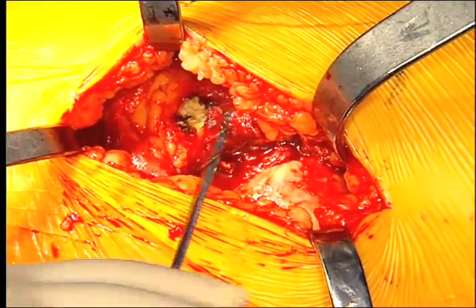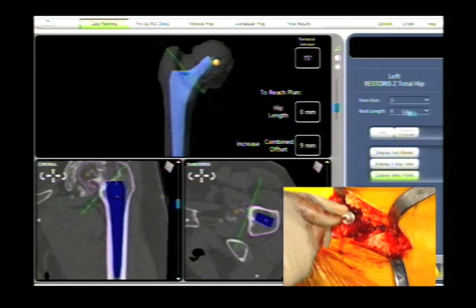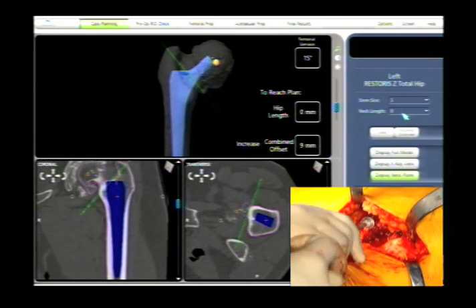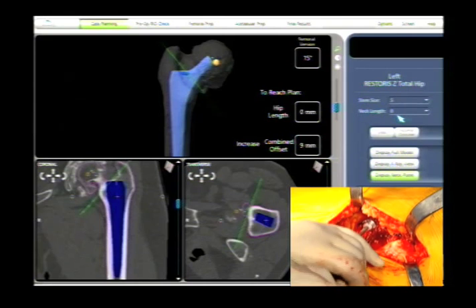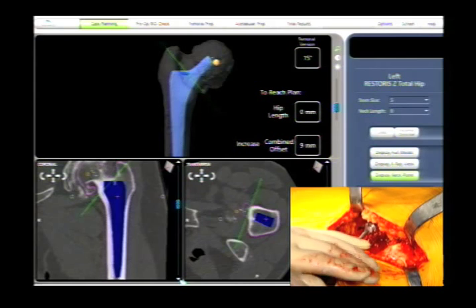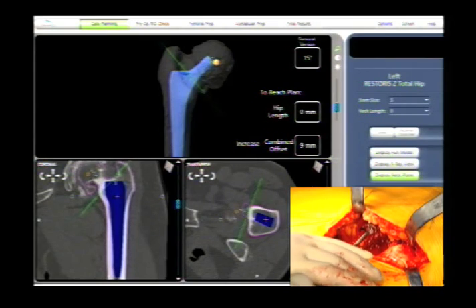While I'm putting the registration screw in, we'll put the femoral plan up on the computer screen. The femoral plan sizes the femur — it's a size 5 stem on this plan, the same size I templated on the x-ray. We have both an x-ray template and a CT scan, and we're using the MAKO robotic assist to convert what's in the computer with the CT scan to the patient's actual anatomy via this tight femoral array screw, which must stay there throughout the procedure.